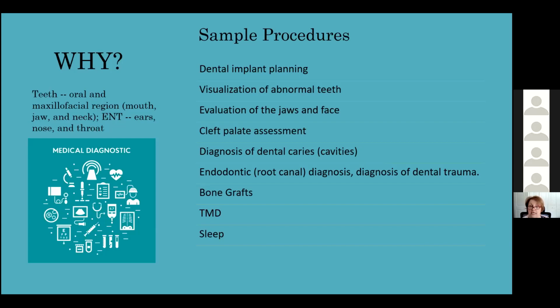Orthodontists take scans for a lot of pedo patients, and they're seeing the closed airway in color, bright and shiny. And so what is that doing for a child who's now being diagnosed with attention deficit disorder? And when you see that there's a closed airway, the collaboration of treatment grows tenfold for that child.